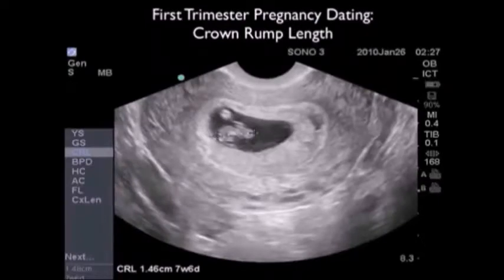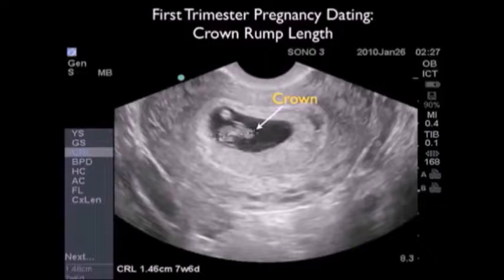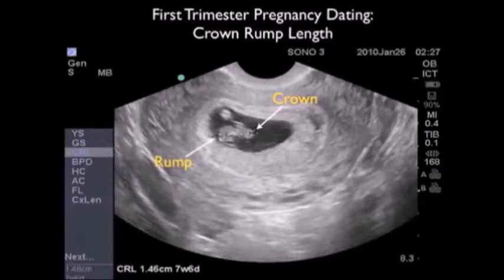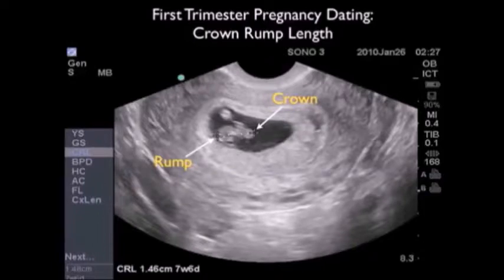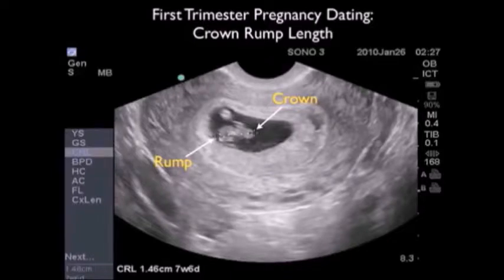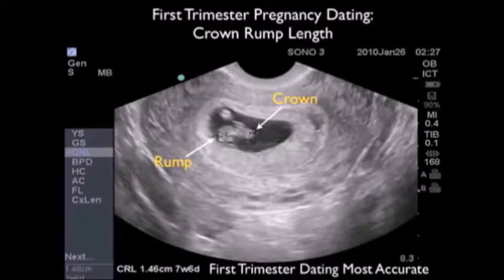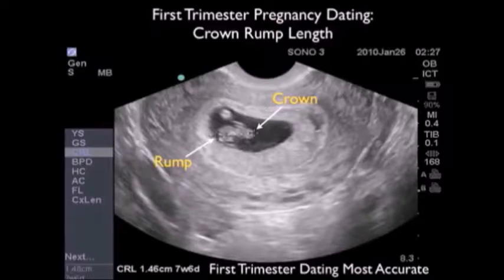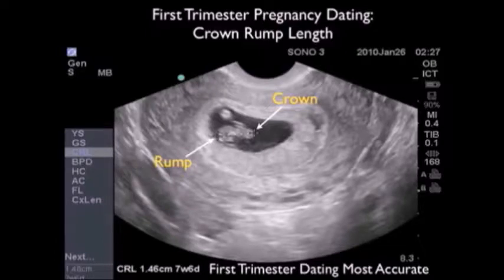This is an image of a first trimester pregnancy, and we're going to evaluate the gestational age by measuring the crown rump length. Here we see the fetal pole stretched across the gestational sac, with the crown located towards the right and the rump towards the left. Placing the calipers from crown to rump, we get a measurement of 1.46 centimeters. By selecting crown rump length in the software package on the ultrasound machine, we get an assessment of gestational age: seven weeks and six days.